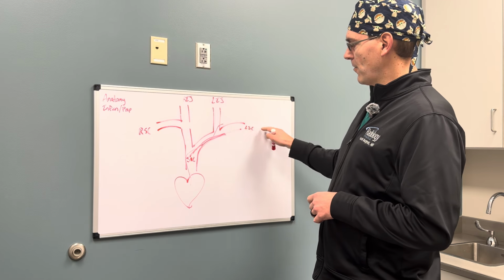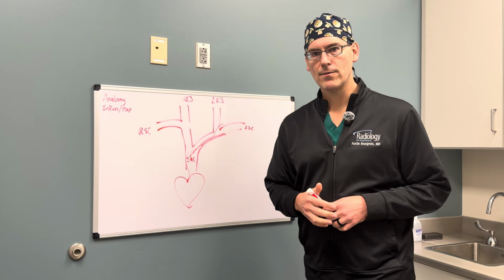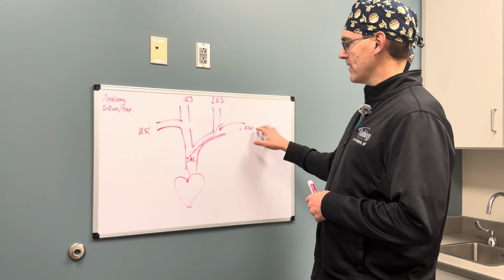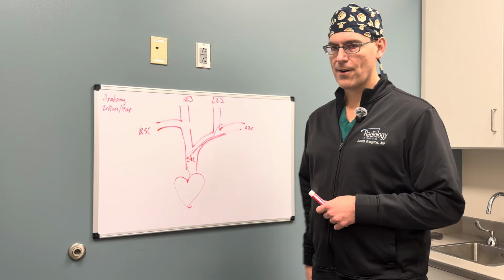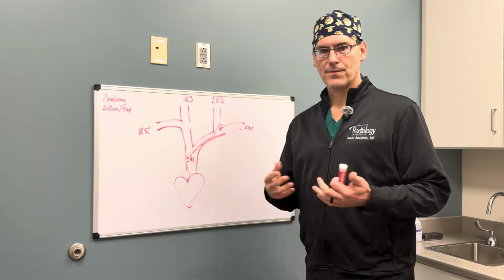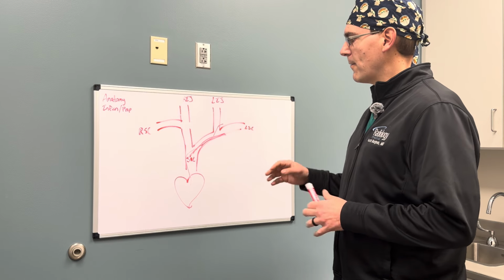These veins are very important for dialysis fistulas in patients who are on dialysis or who may be on dialysis in the future. And if there's prolonged PICC line contact with the axillary, subclavian, and brachiocephalic veins coming from the left arm, then you could see how you could end up in pretty short order with a central venous stenosis. So that's an overview of the anatomy and how we think about that.